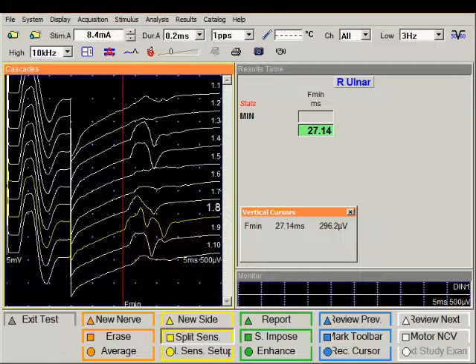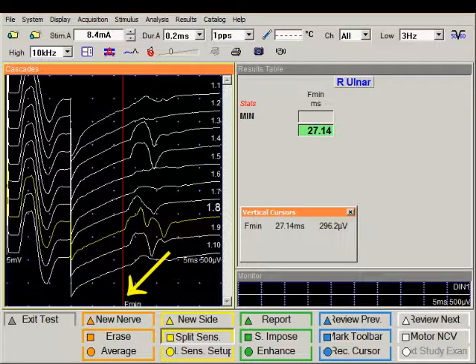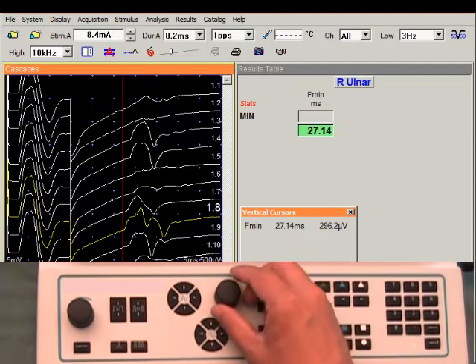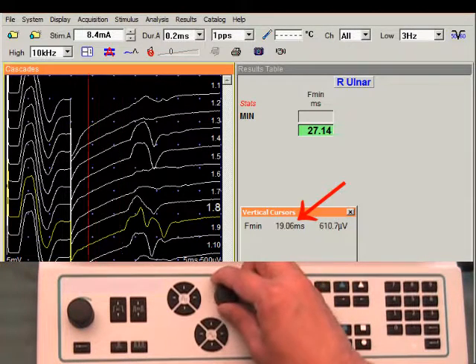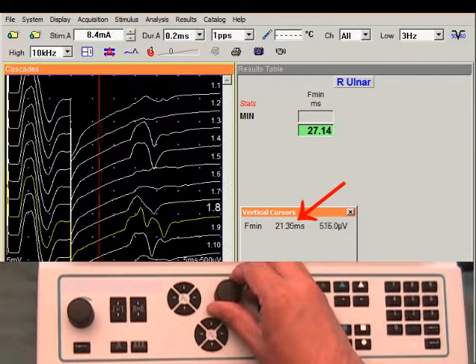The system recognizes the F-Waves. The yellow trace signifies the F-Wave with the shortest latency. The red cursor coincides with that latency. If you do not agree with that latency and want to make a change, use this cursor knob to turn the latency to the one more desirable.